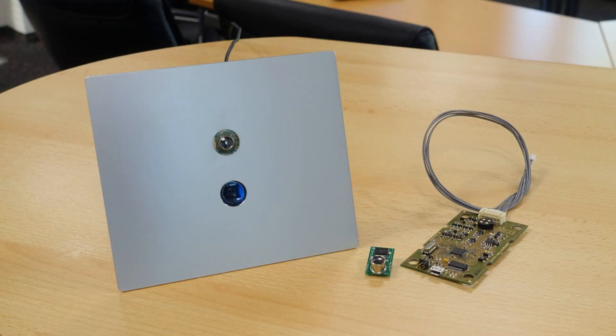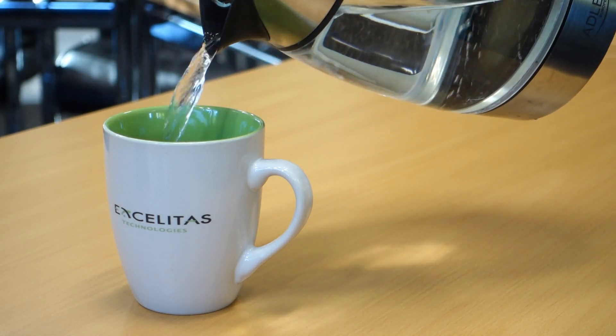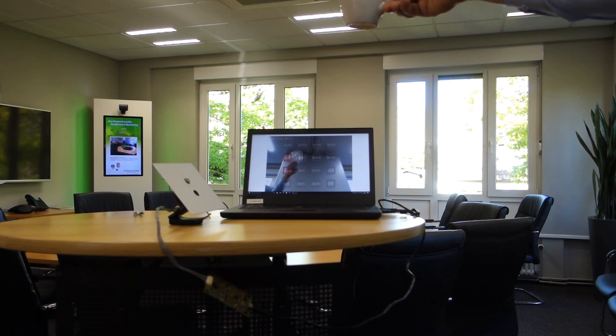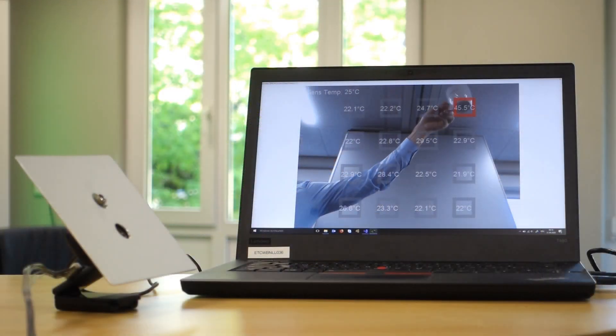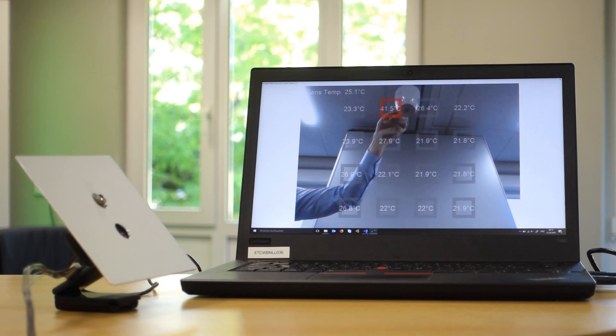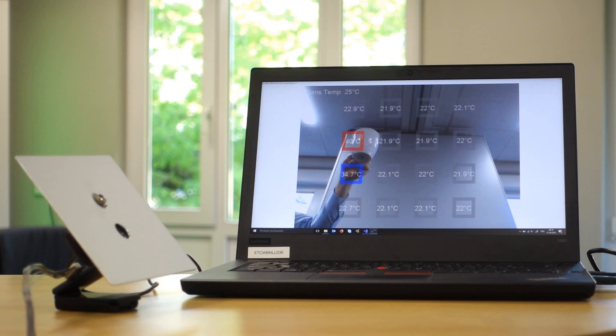Here we combined a 4x4 pixel sensor with our camera. To align the sensor's field of view with the camera you can use a very hot object, as tracking a hot object is much easier. If you use a calibrated heat source you can adjust the emissivity in the sensor in order to display the correct absolute value.